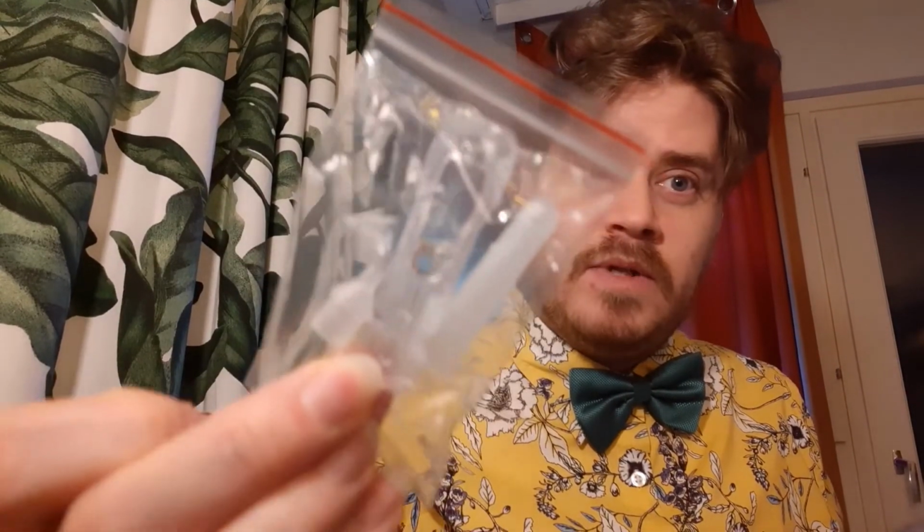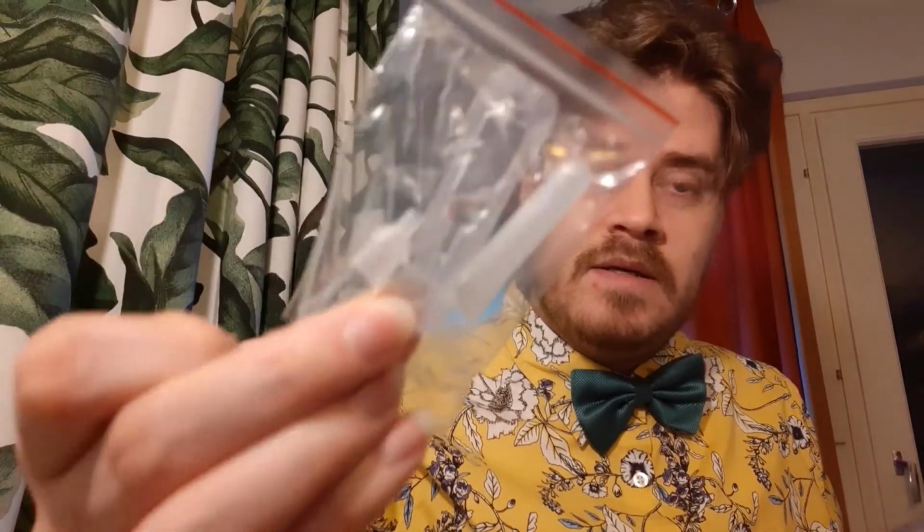Apply the drops to the test specimen only to the specimen well, S. And we'll see that in just a moment. Too many or too few drops of extraction solution can lead to an invalid or incorrect test result. Okay, so we'll watch out with that solution, which I'm assuming is what we have in this little ampule here. You can see the liquid inside. And then the cap, I'm assuming, is for capping off the swab afterward, as it might have infectious material on it.